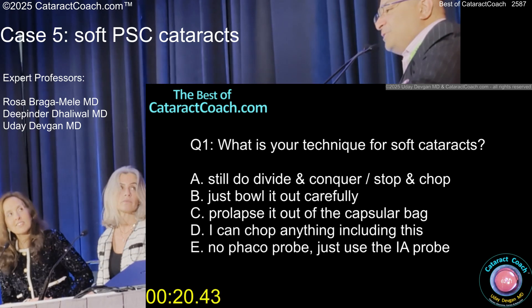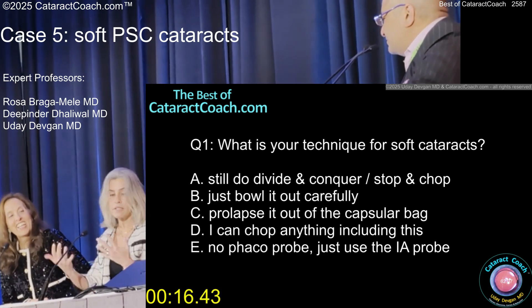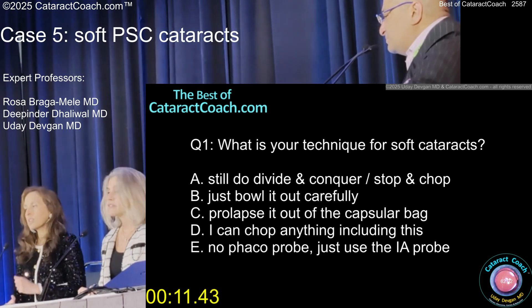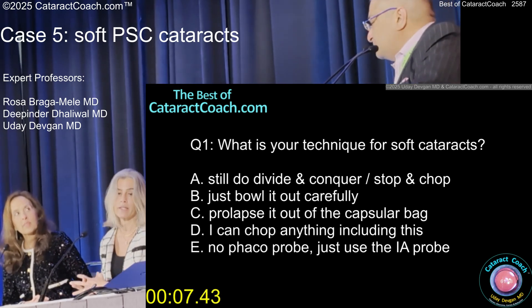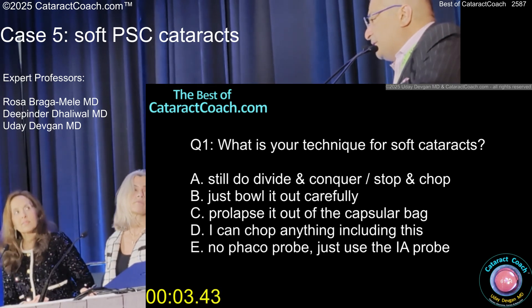Rose is exactly right. God, I would do the exact opposite — I just get it out of the bag. I don't want to touch the bag. But then issues can happen. You're expanding the bag with the epi-nucleus. Get the nucleus out, but if you get it out of the bag, put viscoelastic behind it and fill up the bag, and then put your CTR on. I always get problems from those wrinkly old bags — I'm talking about the lenses, not the patients.